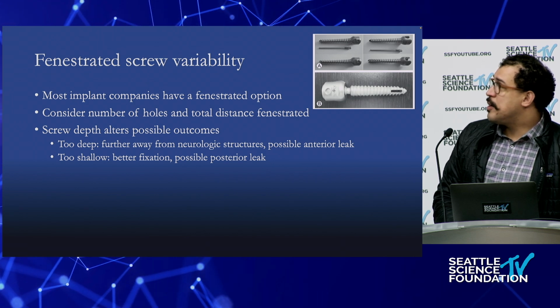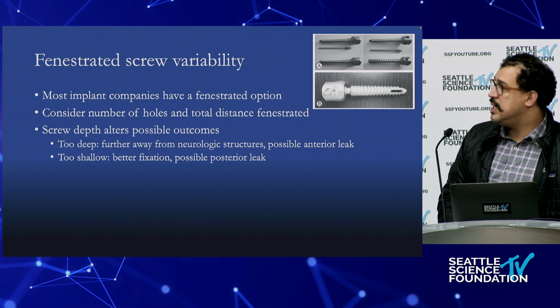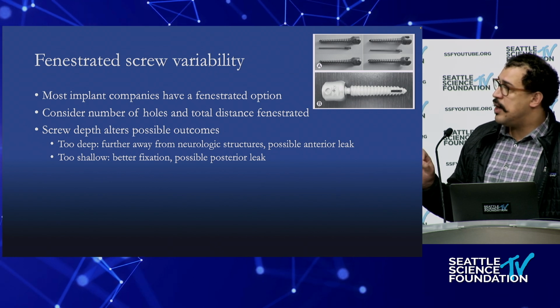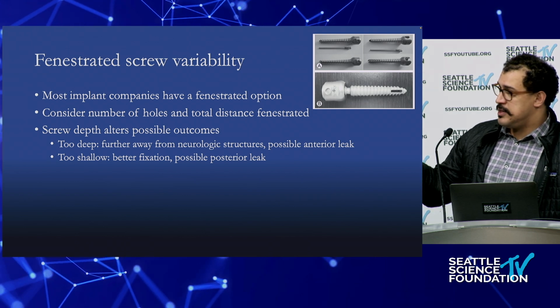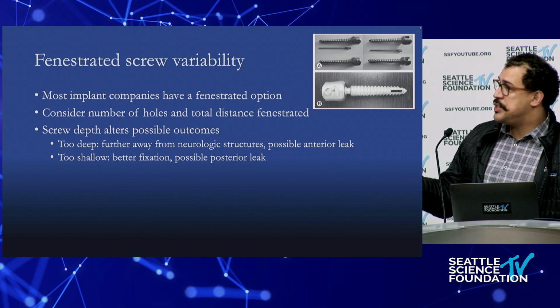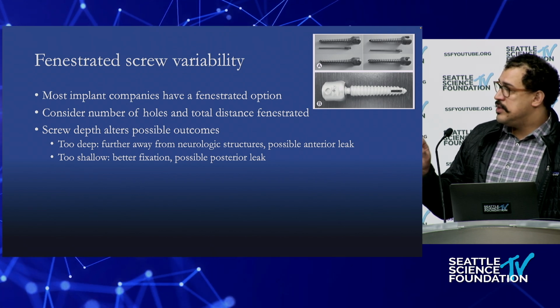And just briefly want to talk about things to keep in mind. The fenestrations are all very different on the different implants if you are using that technique: how far back the holes go, the total distance fenestrated. You really want to make sure that your technique is sound in terms of cannulating the pedicle. A medial breach will create a pathway for that cement to come back into the canal, which is a very big concern. If you're putting that screw too deep, you can have it extravasate anteriorly, possibly into the venous system, causing that embolization. So really making sure you're taking time to put that trajectory in just the right place.